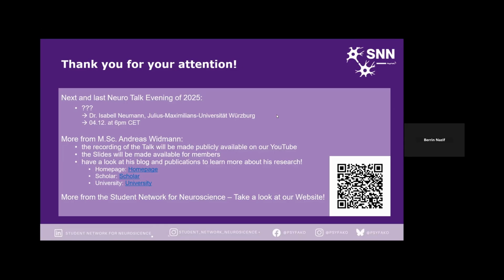Sorry for interrupting. It was something like this: the signal would be going really well, and at some point there would be a large spike, and it would break off for 2 or 3 points, and then it would continue. So I assume that it was some electrode misplacement or movement or something like that.